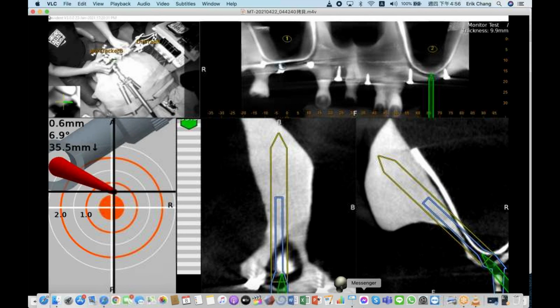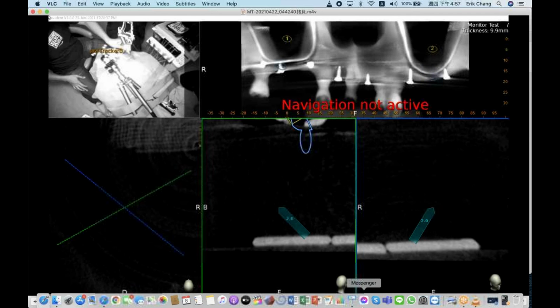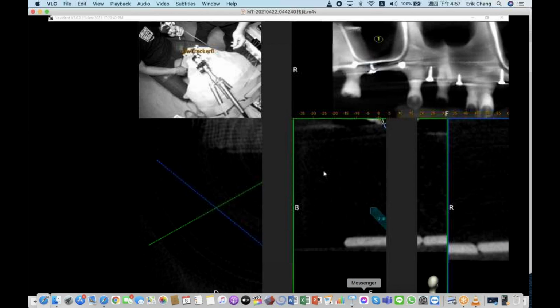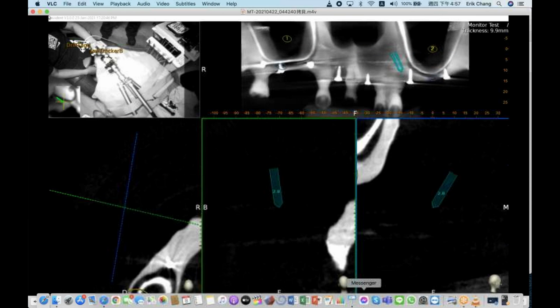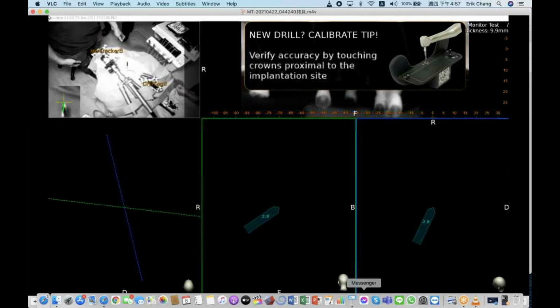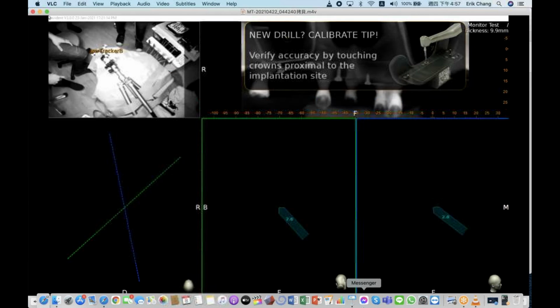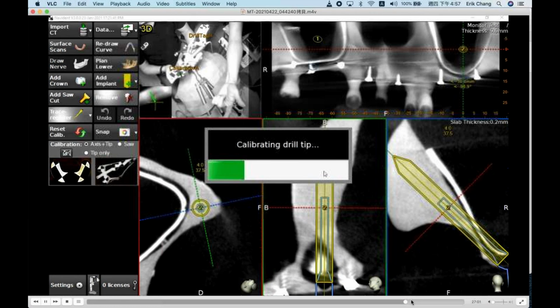Are you using a straight handpiece? No, a contra angle. Yes, but I found another handpiece that makes placing the zygoma implant much easier. I will send you the handpiece information later. Okay, good. Is it a contra angle or a straight one? It's a contra angle, and it's from W&H, but I cannot find it in the Taiwan market. Maybe you can find it in your market.